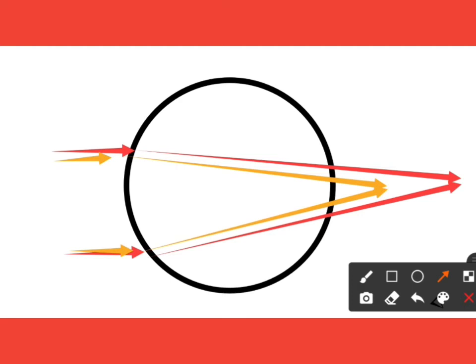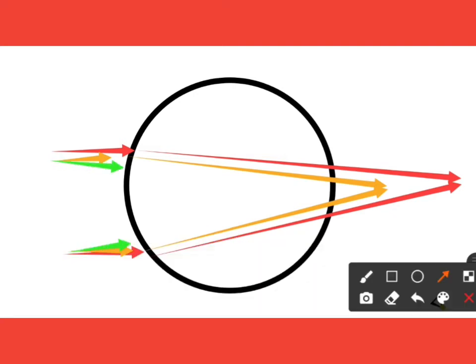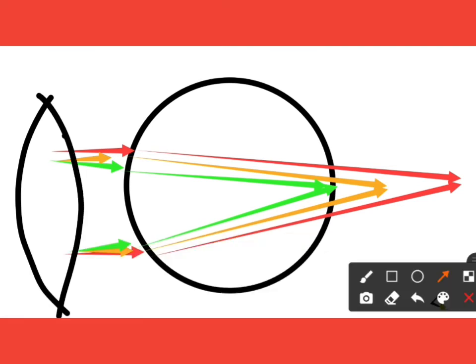But as the patient has hypermetropia, it can be due to axial hypermetropia or curvature hypermetropia, the wavelength that earlier focused on the retina is now focused behind the retina. Here green will now be focused on the retina, and the patient will say that the green background letters are clearer than red. In this condition we will place convex lenses. This convex lens will converge the light rays more.